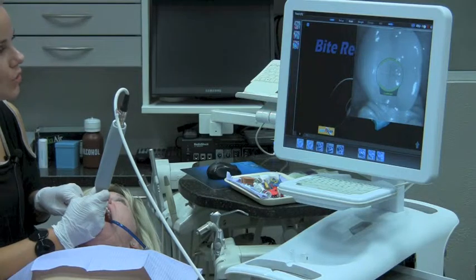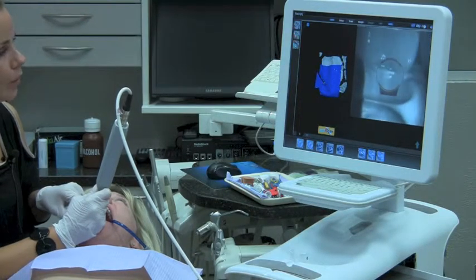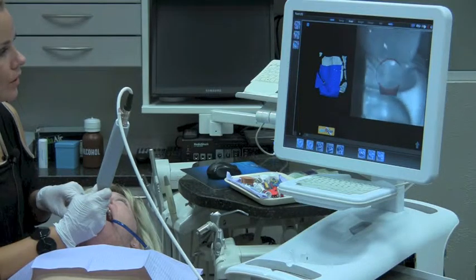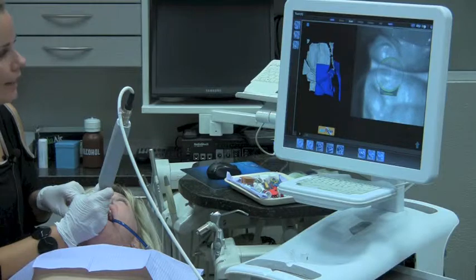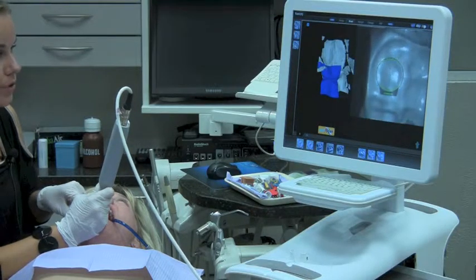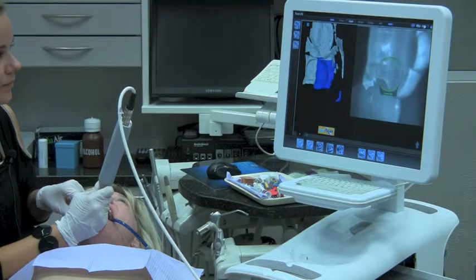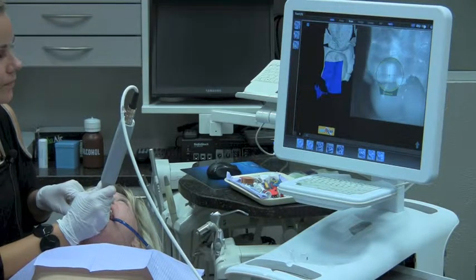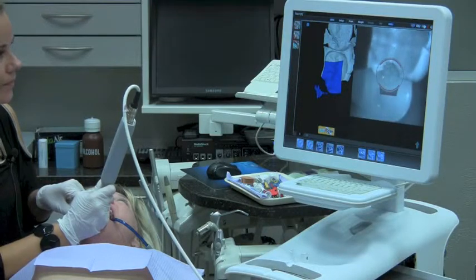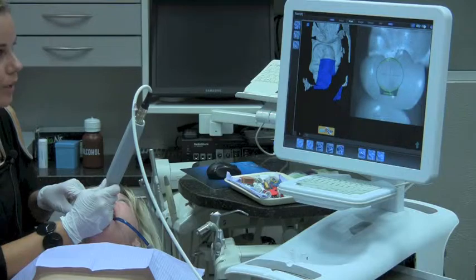We're capturing the distal neighbor with a zigzag pattern back and forth. I'm able to capture the bite registration and the common data, which are the neighbors — and of course the common data on the mesial aspect, which is the mesial neighbor.